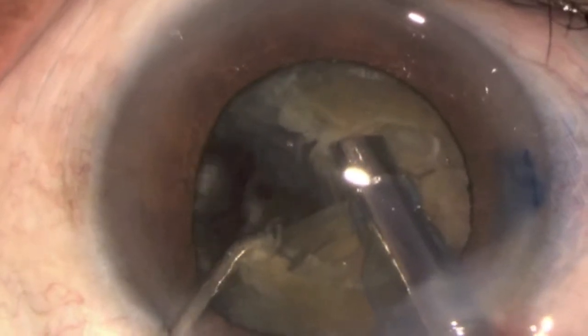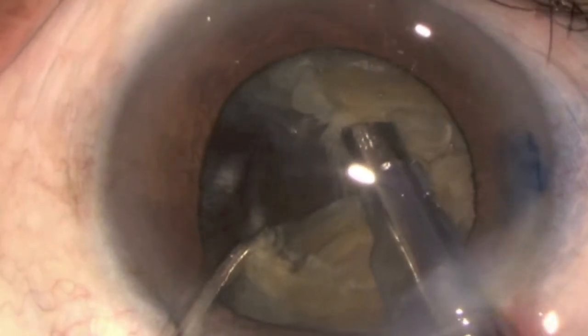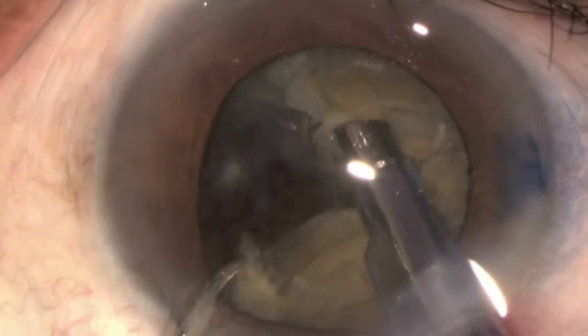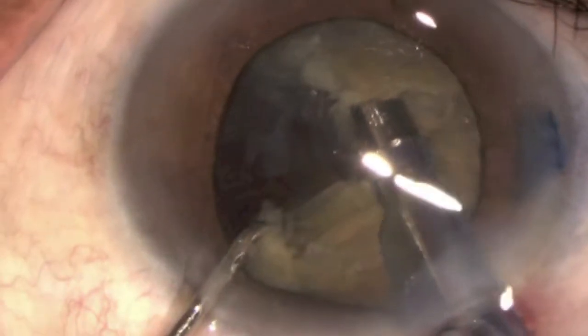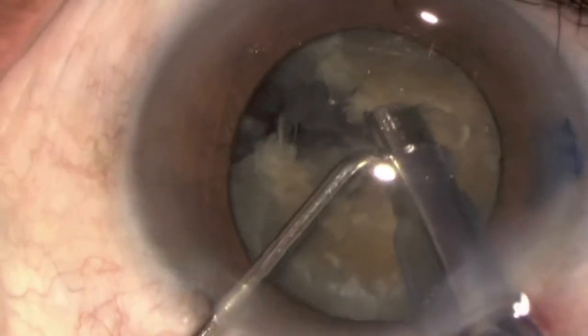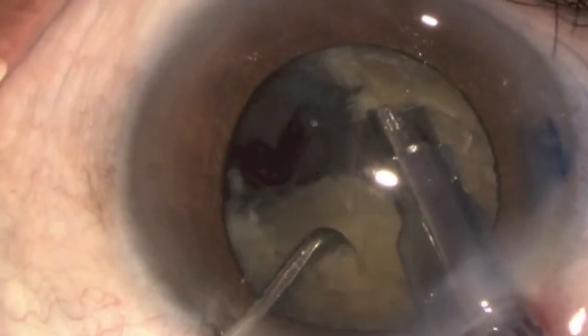Lateral separation of both the instruments creates a vector force which tears the full thickness initial nick from equator to equator through the center, segmenting the entire nucleus along a clean cleavage plane between the lens fibers.